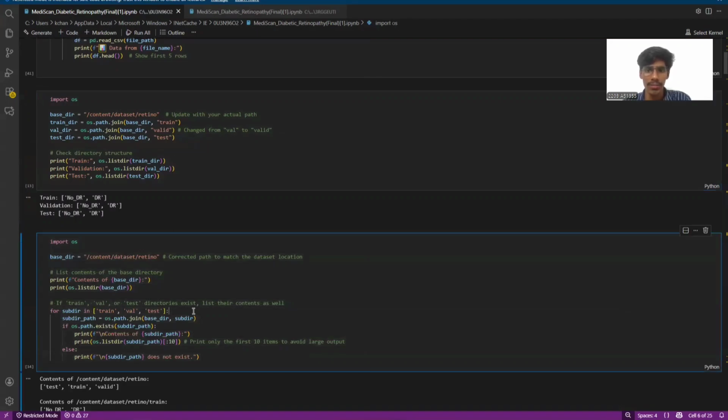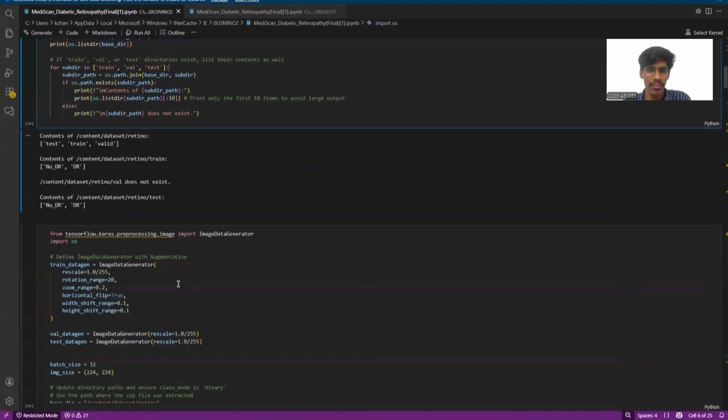In the fifth cell, the code verifies your data structure by checking if the train, validation, and test folders exist in your main directory. It lists the contents of the main folder and for each subfolder found, prints the names of the first 10 files so you can confirm that data is present without cluttering the screen.